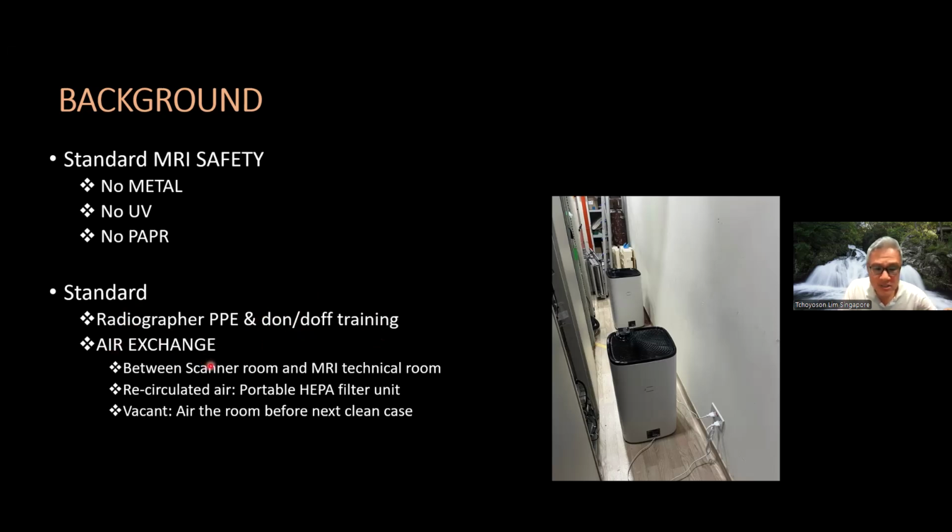Now, in addition to these standard PPE, we also have air exchange. In the MR scanner, there is free exchange between the scanner room and the technical room because people move about to and fro freely. So that means the air exchange needs additional protection using portable HEPA filter units for recirculated air. We vacate the air in the room after we scan a positive infected case before the next case.